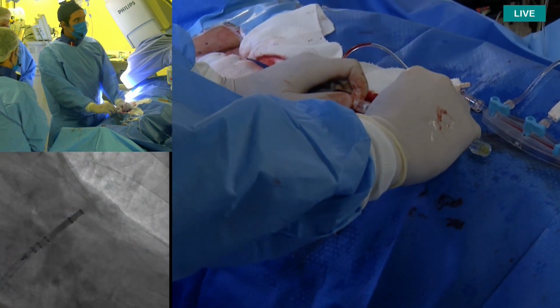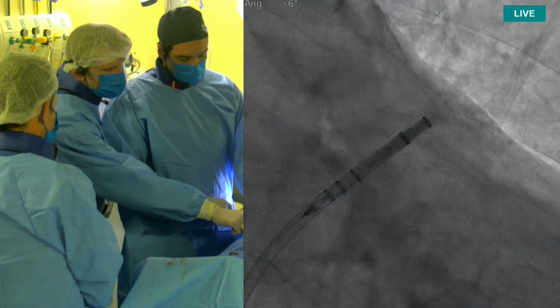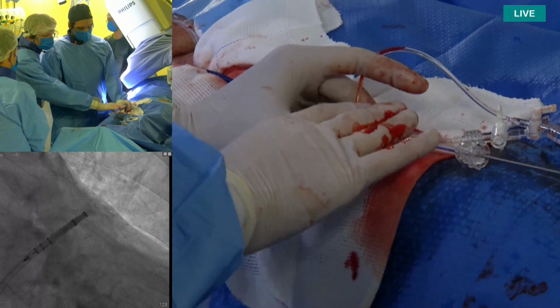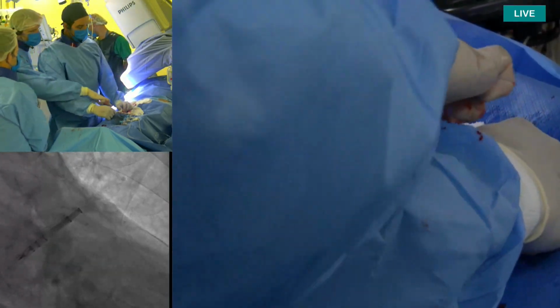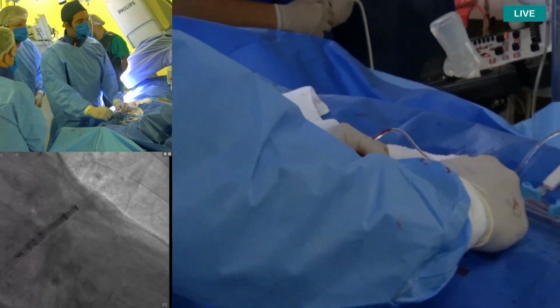So you're going to hear the pop. So we're ready for the attack zone, I would say. So now this white part, that's the device, is connected with this hemostatic valve of the delivery sheath. Now Felipe will bring his hands here to this distal part. And you can open up the hemostatic valve there, so we have the room to play with the device.